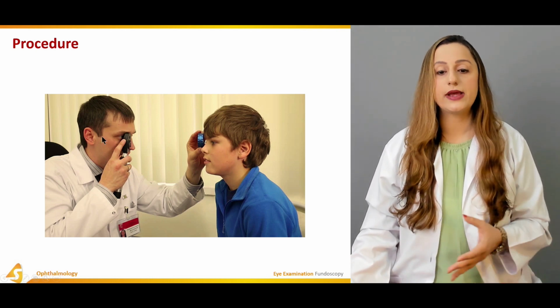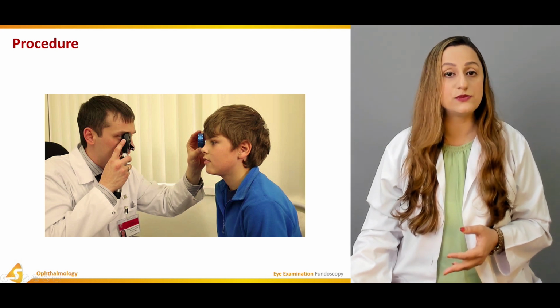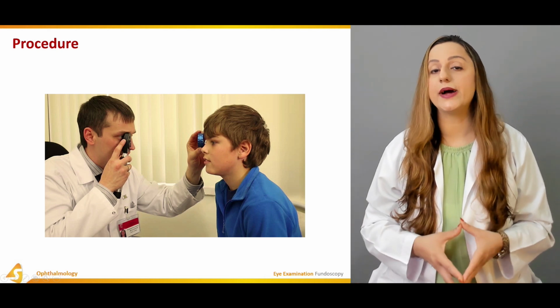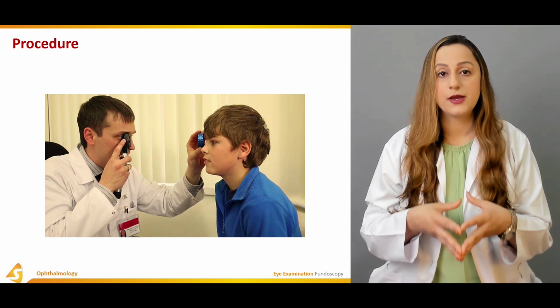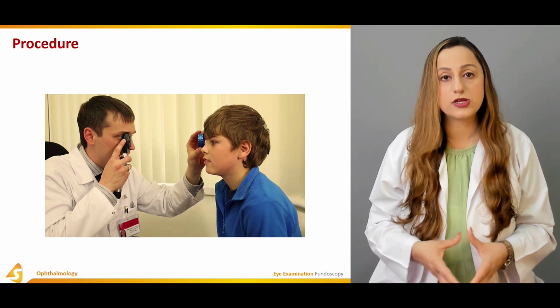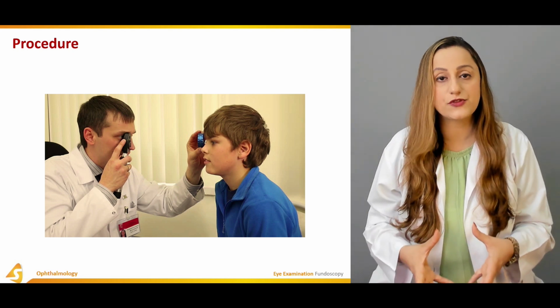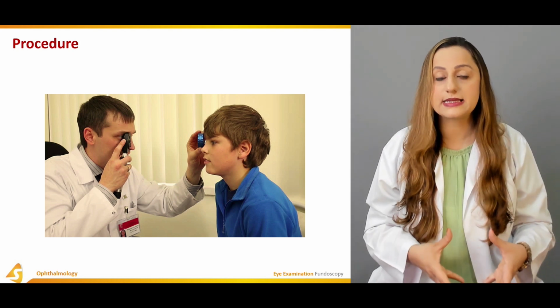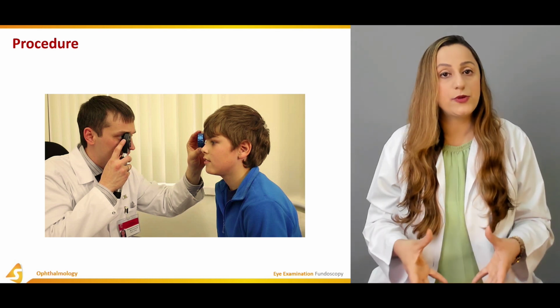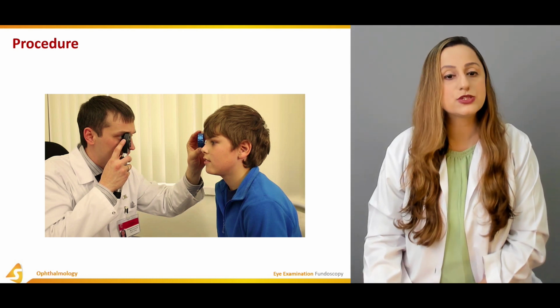That was the literature, and here you can see that you have placed a lens over here. You have an ophthalmoscope in your hand, and you are having a good view at the retina of the patient, and you're going to notice everything that is possible, ranging from the blood vessels that are present on the fundus of the eye. The optic disc is examined in detail, the macula and the fovea. Any abnormalities that are present in the macula and the fovea also have to be documented.